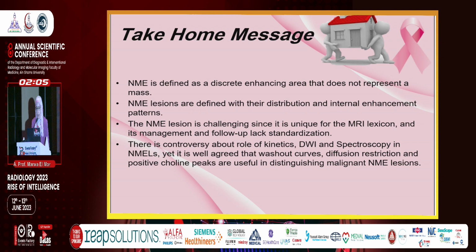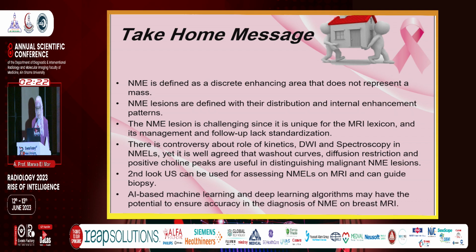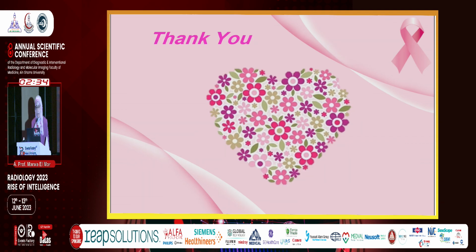Yet it's well agreed that washout type curves, diffusion restriction, and positive choline peaks are useful in distinguishing malignant non-mass enhancing lesions. Second-look ultrasound can be used for assessing non-mass enhancing lesions on MRI and can guide biopsy. AI-based machine learning and deep learning algorithms may have the potential to ensure accuracy in the diagnosis of non-mass enhancing lesions on breast MRI. Finally, thank you.